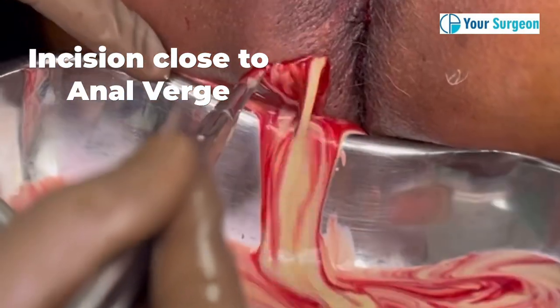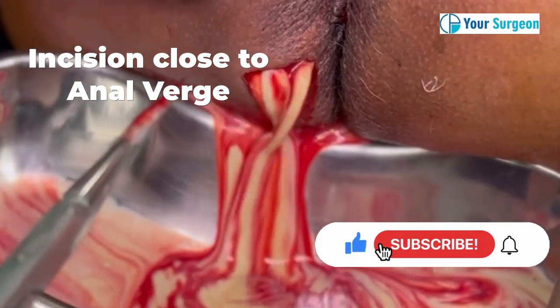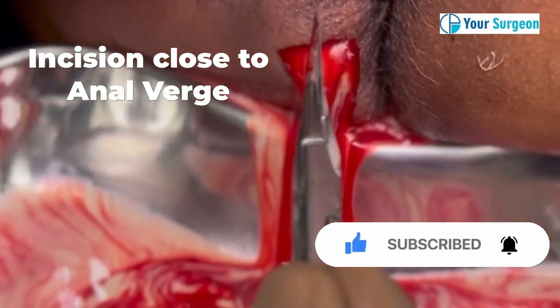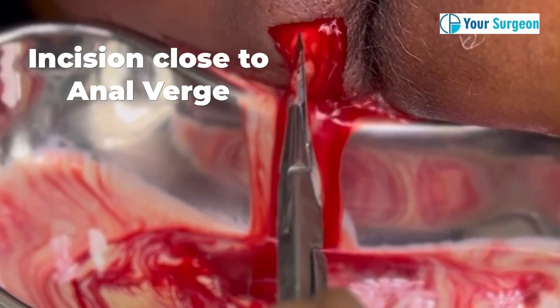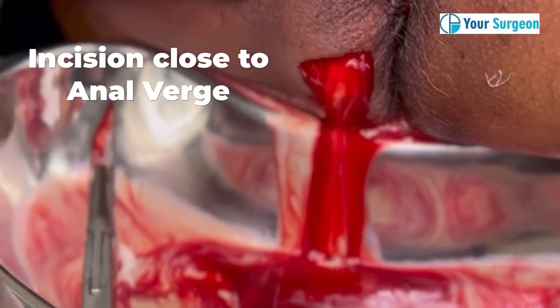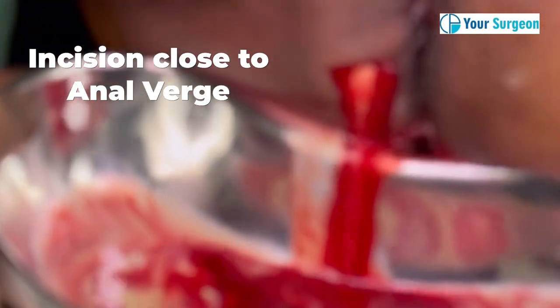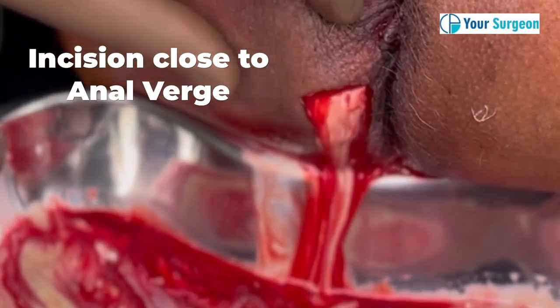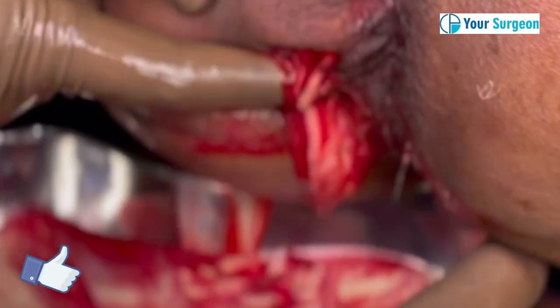Make sure that your incision is always near the anal verge. If you take an incision which is away from the anal verge, then chances are that later on, when fistula formation occurs as a complication of any perianal abscess, it will result in a long track fistula. So always keep your incision near the anal verge.